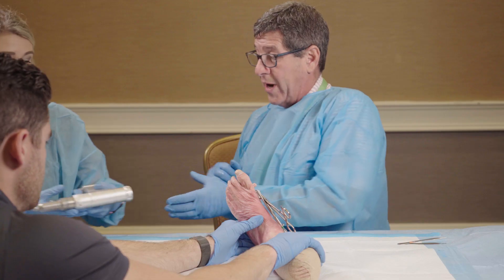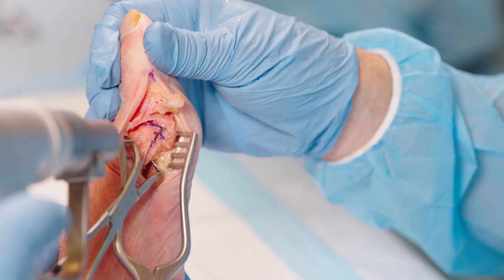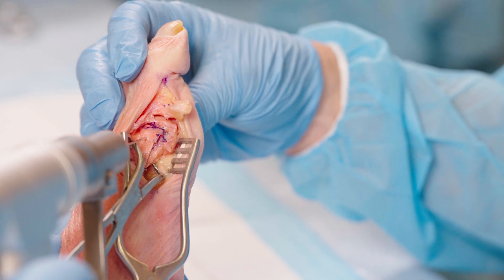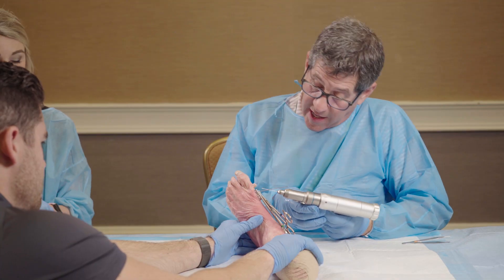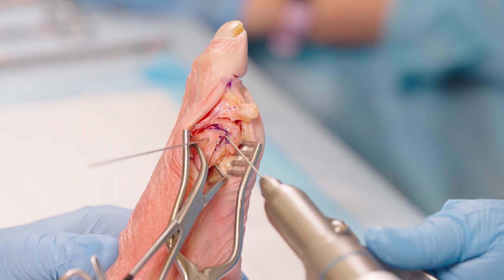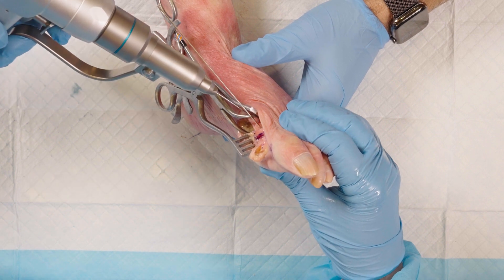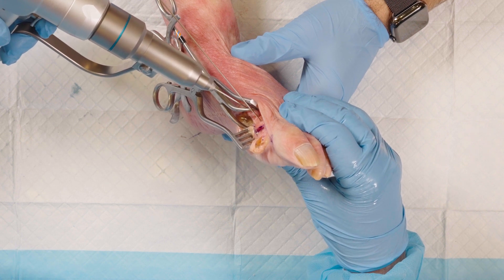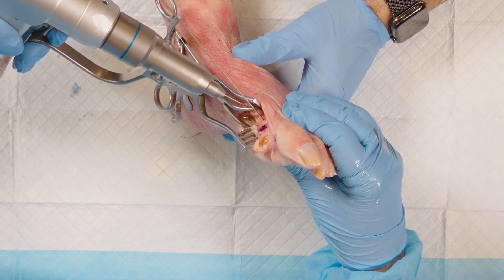Now I'm going to start to fixate it. When I fixate a scarf, one point of fixation goes into the head of the metatarsal. I start about a centimeter proximal to my osteotomy, put my thumb on the crista, and drive the pin into that position. The first pin I put in is distally into the head — it is not bicortical, it's cortical to cancellous bone. My second pin is going to be bicortical and it's more perpendicular to the osteotomy. I start dorsal medial and aim plantar lateral.